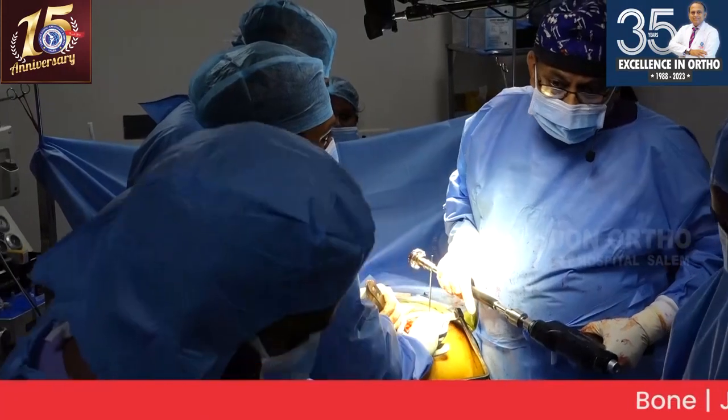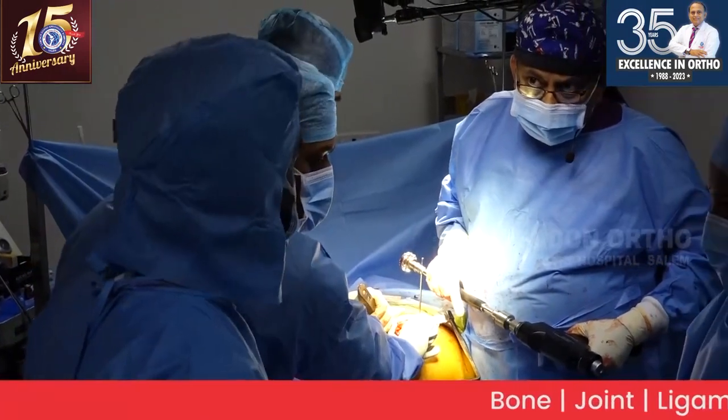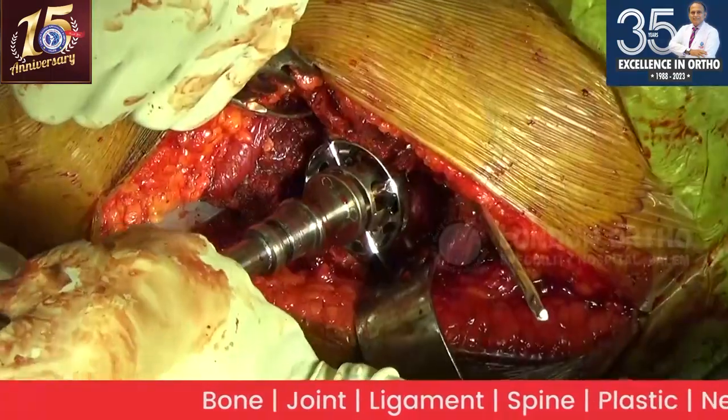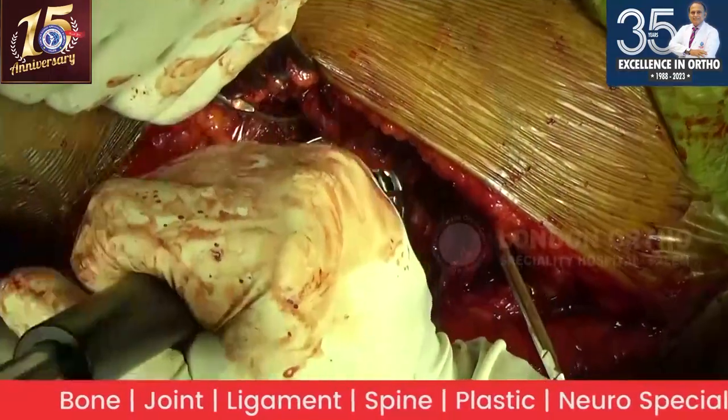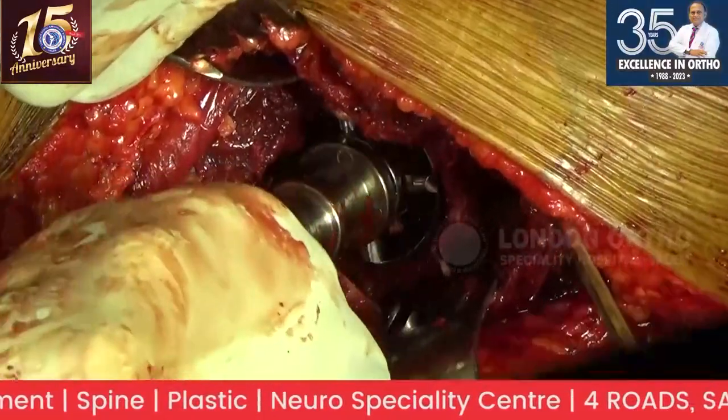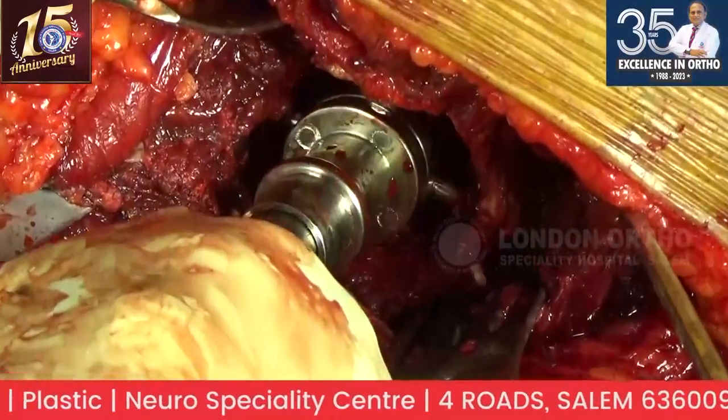48, 50, 40, 30. We have to go to the true floor. There is no compromise on going to the true floor. You have to go to the true floor in 100% of the patients. No compromise on that. Mediolaterally, yes, you have to; anteroposteriorly, you have to preserve bone. You have to put a small size. But the depth is fixed for all patients.